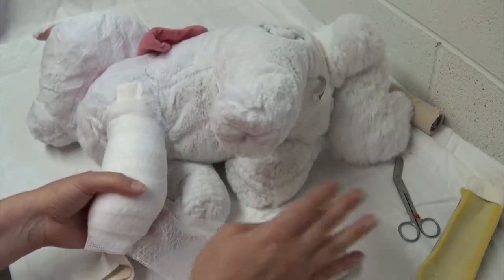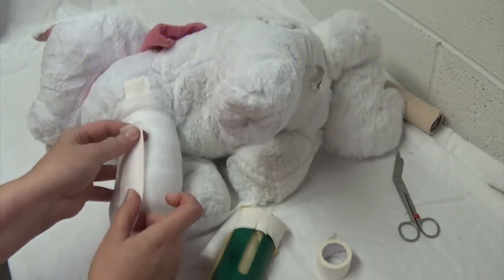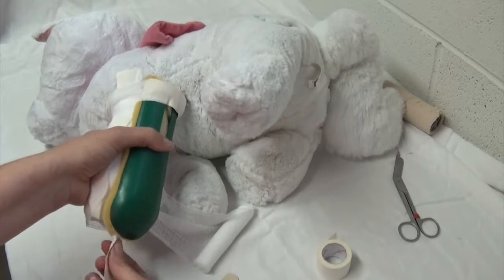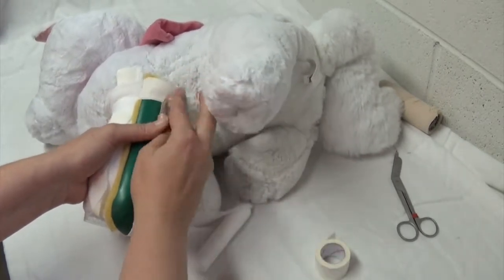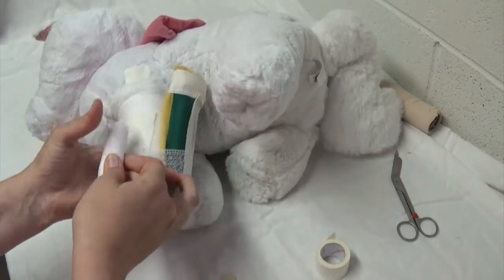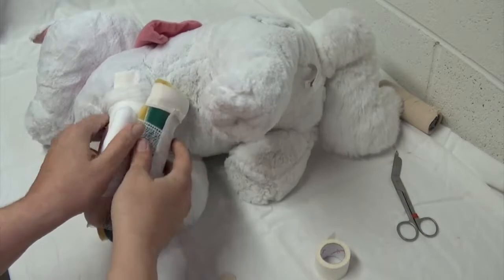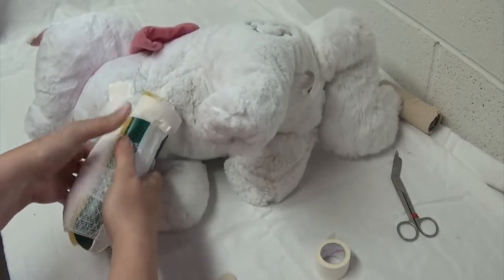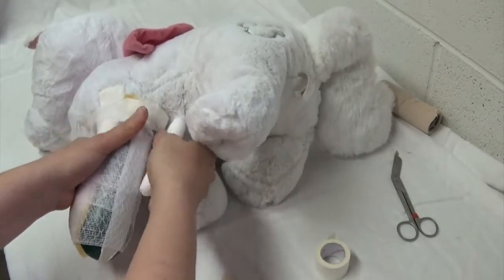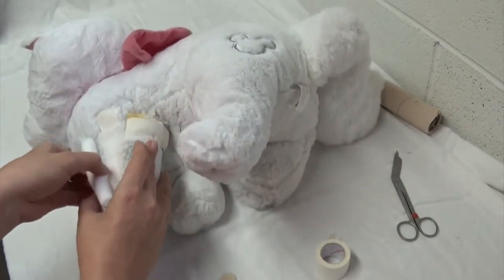Now let the rest fall free and take the spoon splint. Reflect the tape up onto the bandage and onto the splint itself, then place the splint. Remember, the stirrups are what help hold everything together. Take the rest of your cling or stretch gauze and with every pass add a little bit of pressure to hold the splint on. I'm adding a bit more tension than the first layer because I really want that limb to seat into the spoon splint. This is also why we've padded the top — to prevent rubbing, decubital ulcers, and chafing.